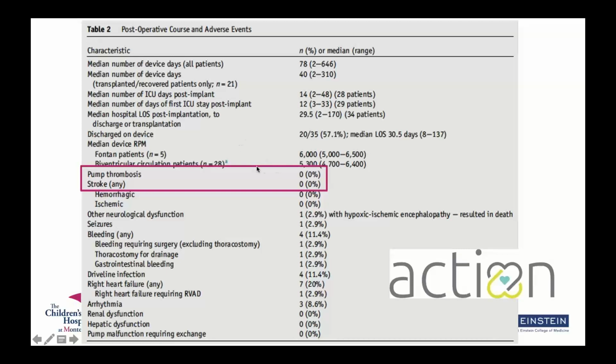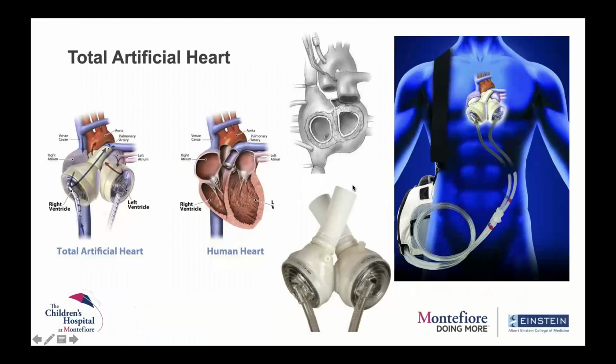And the most important part is that in their study of, I think, 35 patients, they saw no pump thrombosis, no strokes at all. So these patients were supported for 78 days. A median number of days was 40. So these patients were supported for a decent amount of time, and there were absolutely no strokes or pump thrombosis.